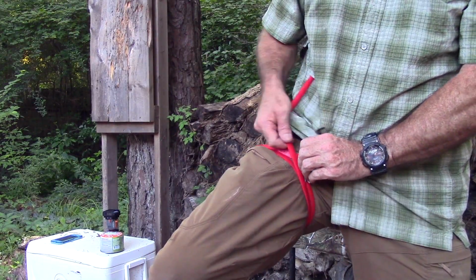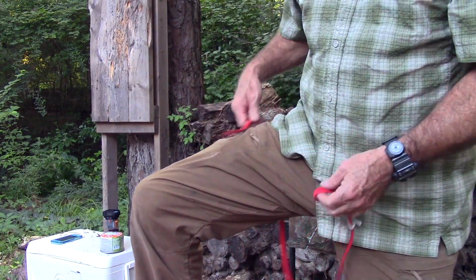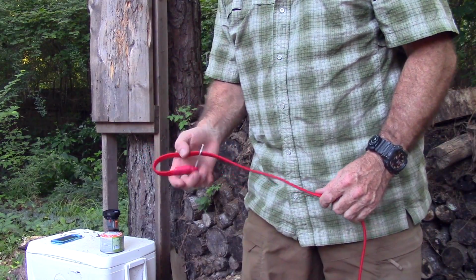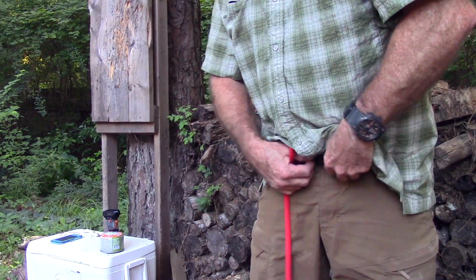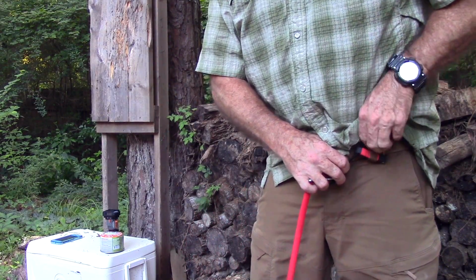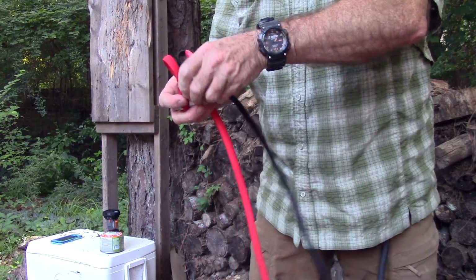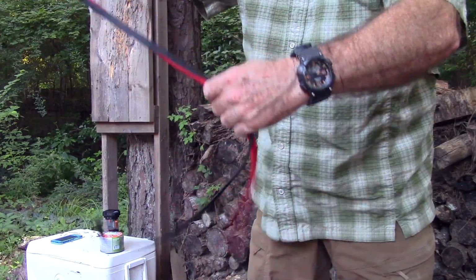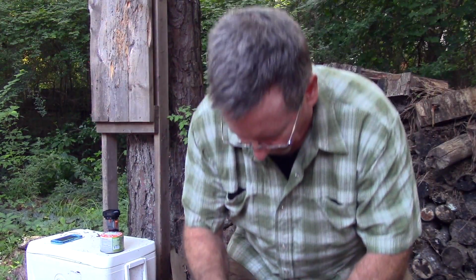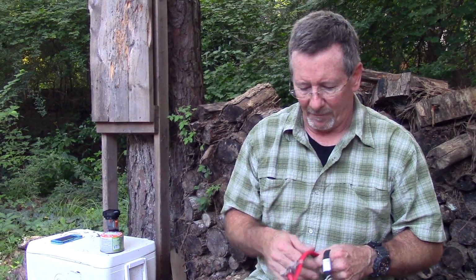So you can see it's on my leg now. I can feel it. On your legs, it's hard to get more than a couple of wraps there. So they came out with the 2.0, and I've got one here. I'm actually wearing this, and I learned this carry method from John Lovell on his video, so I'll put a link to that below. I'm not going to steal his technique here. The 2 is a little bit longer, maybe 3-4 inches longer. I got the black one because if I carry it around my waist, it's not as noticeable if my shirt pops open.